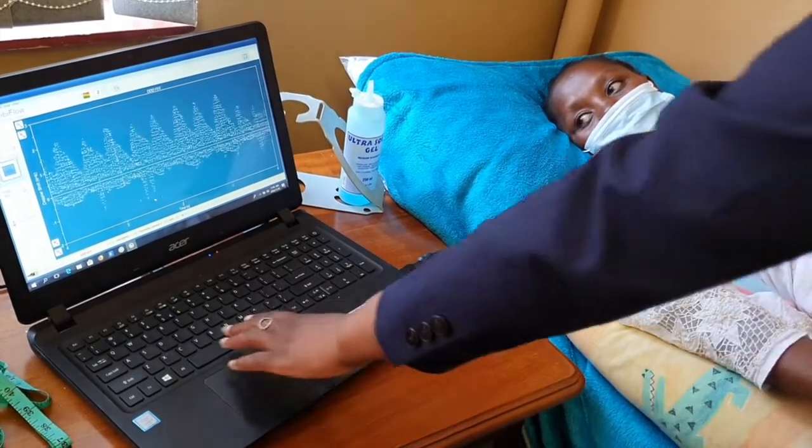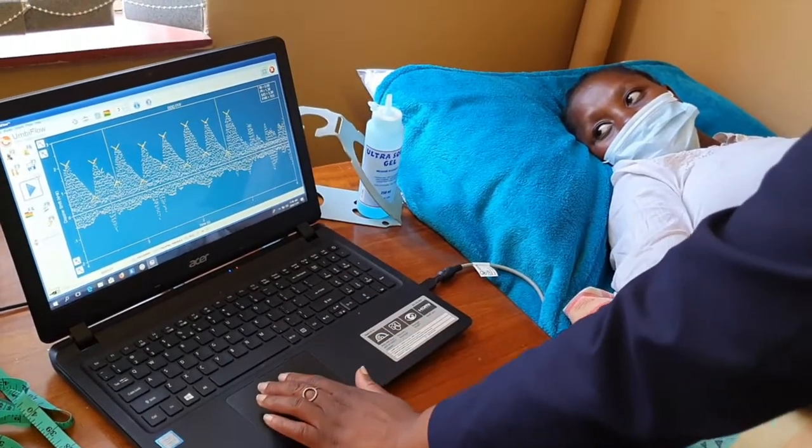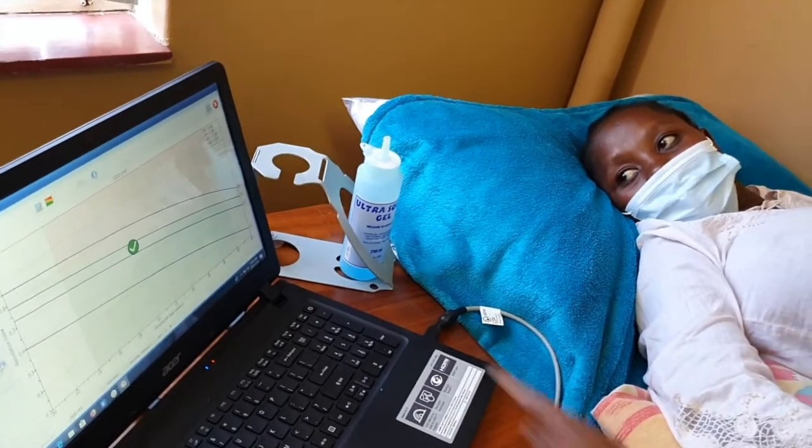The next woman is 30 weeks pregnant and has no known antenatal risk factors. The RI obtained via Umbiflow is 0.68 and is below the 75th centile for the gestational age.